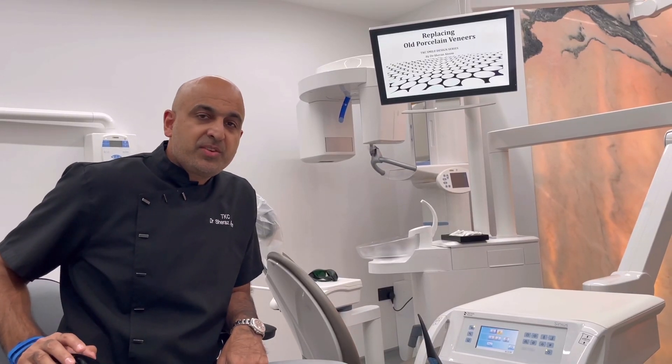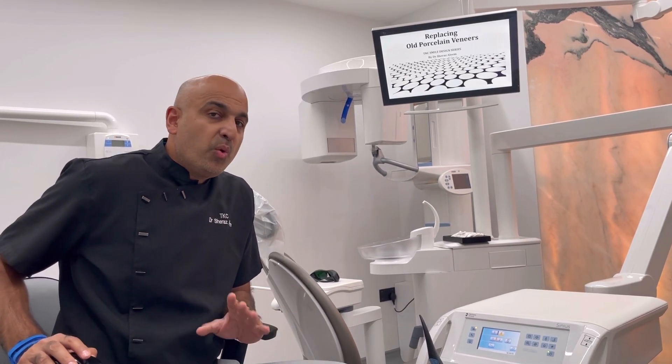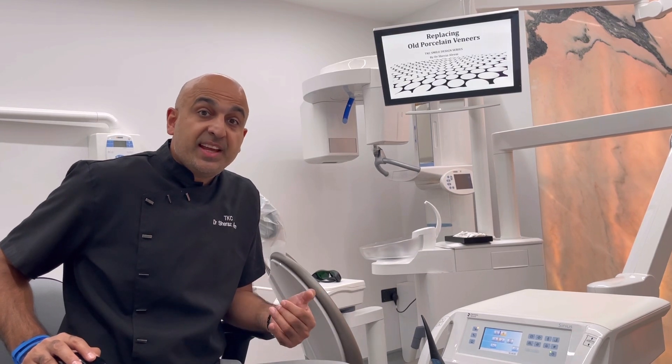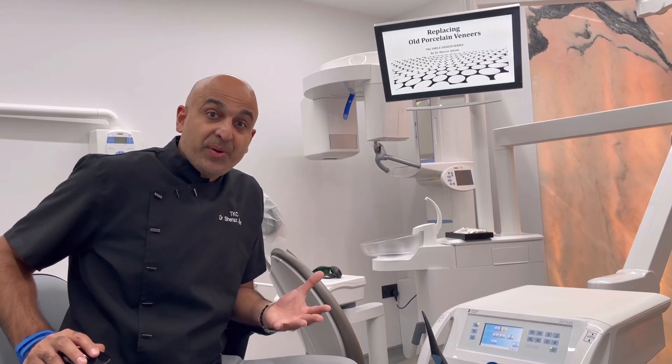Welcome to the TKC Smile Design Series. This is a case showing the replacement of old porcelain veneers. We do a lot of these cases — patients come in and say they want their veneers changed for whatever reason, and I'm going to showcase how we do it.